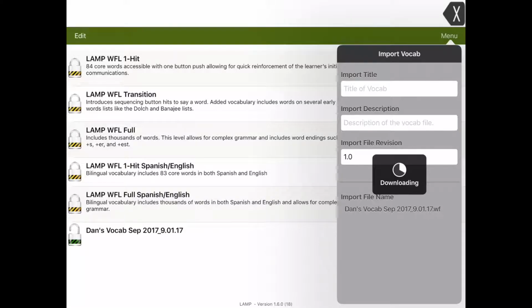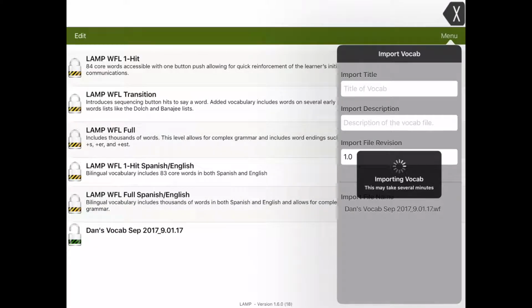And while we're waiting for this to download, I'd like to stress how important it is for Dan to be able to access his vocabulary. A big part of success with an AAC device is consistency with motor planning for formulating complex thoughts. If Dan doesn't have his vocabulary, he may be frustrated that he can't communicate as seamlessly.